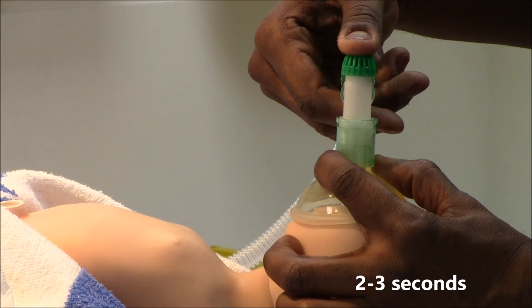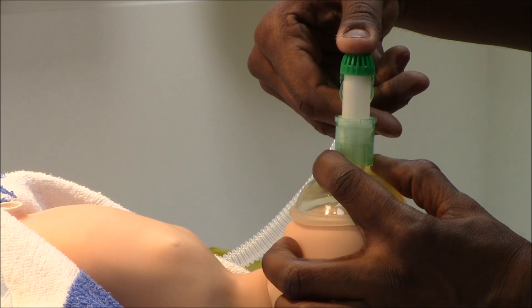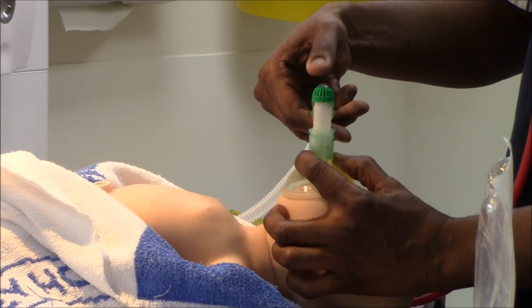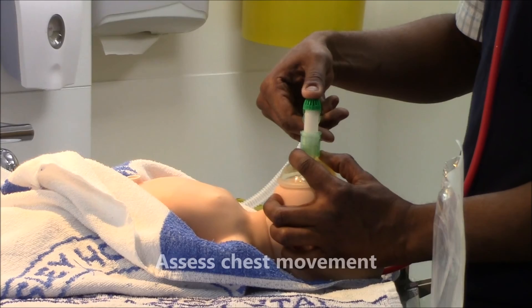1 and 2 and 3, 2 and 2 and 3, 3 and 2 and 3, 4 and 2 and 3, 5 and 2 and 3.